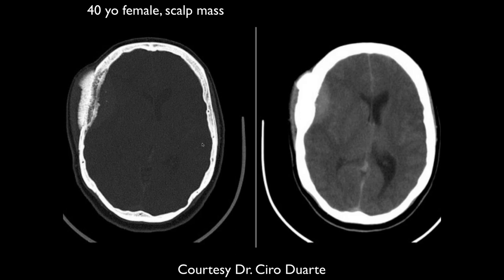No, thank you. It's a 40-year-old with a scalp mass. And there's a lot of thickening of the skull. There's also some kind of either soft tissue mass extra-axially under that, or I don't know if it's blood or what, and I guess some soft tissue swelling over it, or just muscle, I'm not sure. But it looks like kind of fuzzy bone growing out of there. I would wonder if this was, I mean, the age is inappropriate for Ewing's, but it looks an awful lot like Ewing sarcoma. I wonder if there's a primary bone malignancy here.